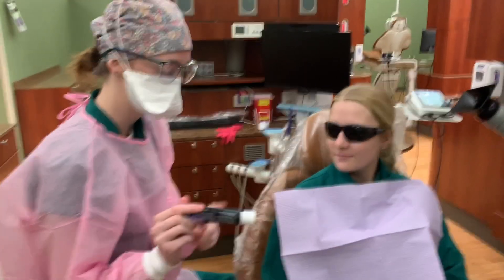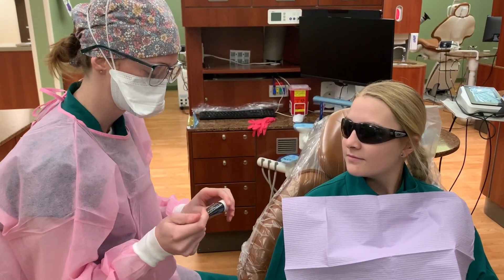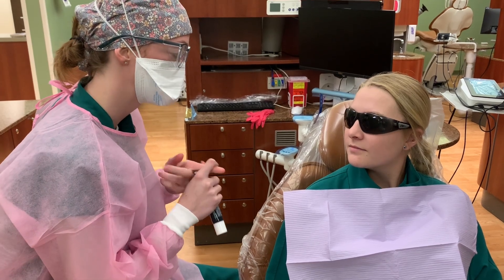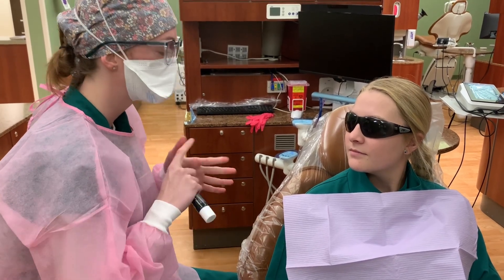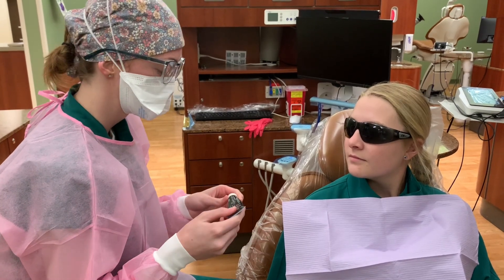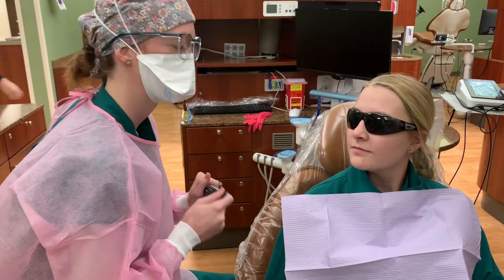So we're about to use the Tri-Plaque ID Gel. This is really helpful because it'll turn your teeth different colors based on where the plaque is and what stage it's at. There are three different stages, and depending on the stage it's at, it'll look different. We're just going to paint this on your teeth and then we'll talk about where the plaque is located.